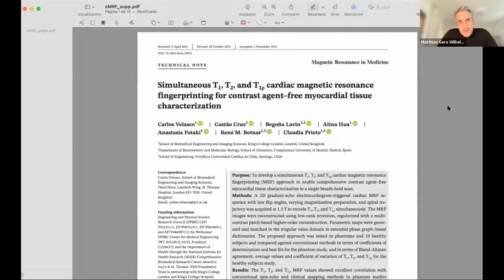So that's a significant time saver. And I think with machine learning tools, with new tools, it will probably be possible to use the information from T1 and T2 with T1rho, maybe in combination with Cine, to extract information that reflects something you otherwise would only get with late gadolinium enhancement, like irreversible injury. That makes this a very interesting and important approach.